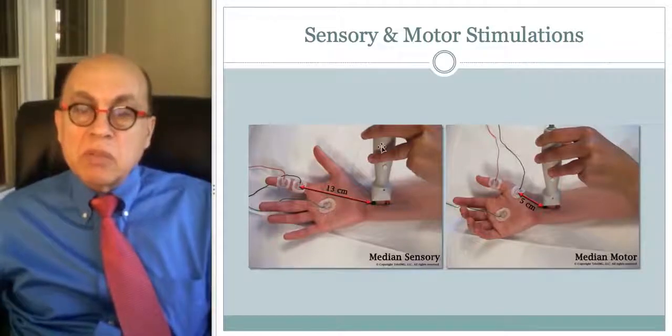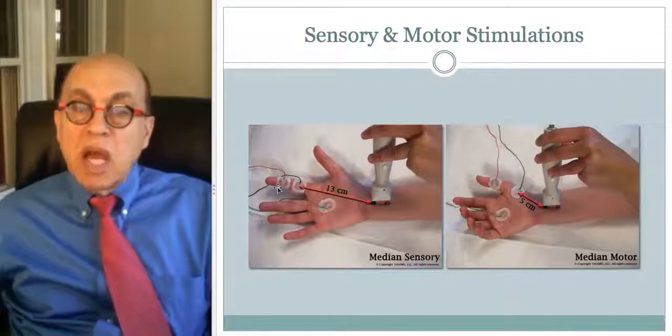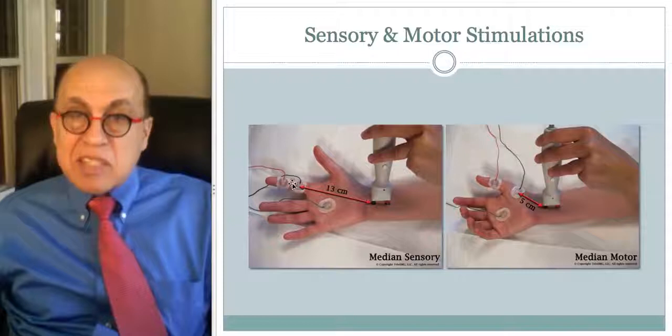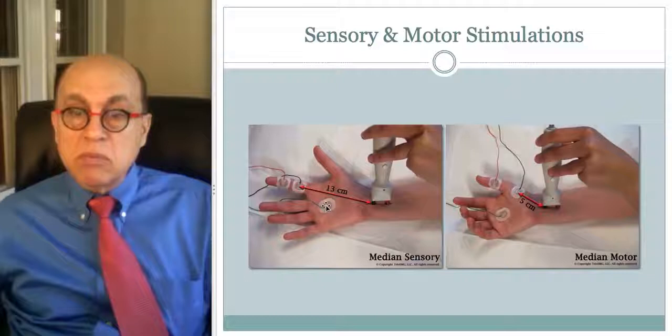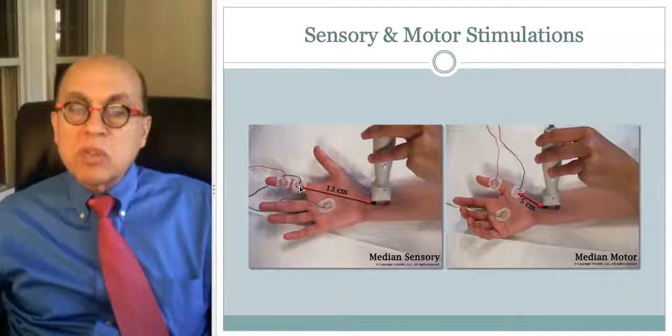Here's a stimulator. I'm positioning it over a nerve, and I'm recording from the finger. There are no muscles in the finger. So basically, in this case, I'm recording from nerve. You can see the 3 electrodes that I spoke to you about. The green is the ground. It's put somewhere on the hand in a relatively silent area. This is the black electrode. That means it's right on top of the nerve. This is the red electrode, the reference electrode.